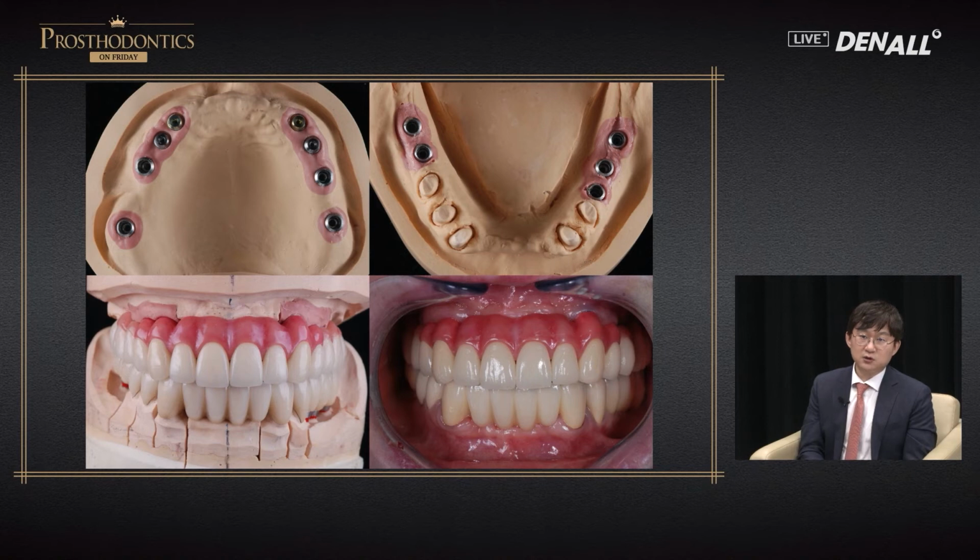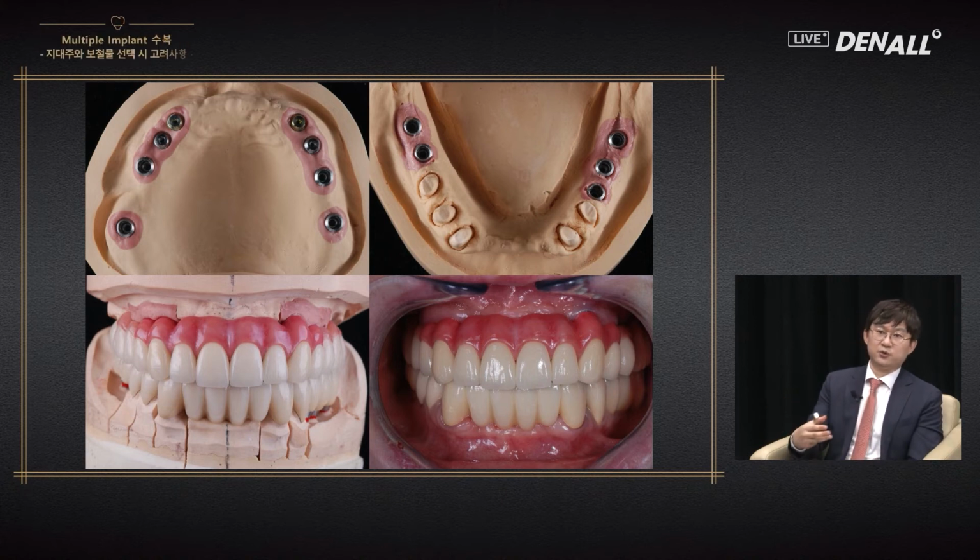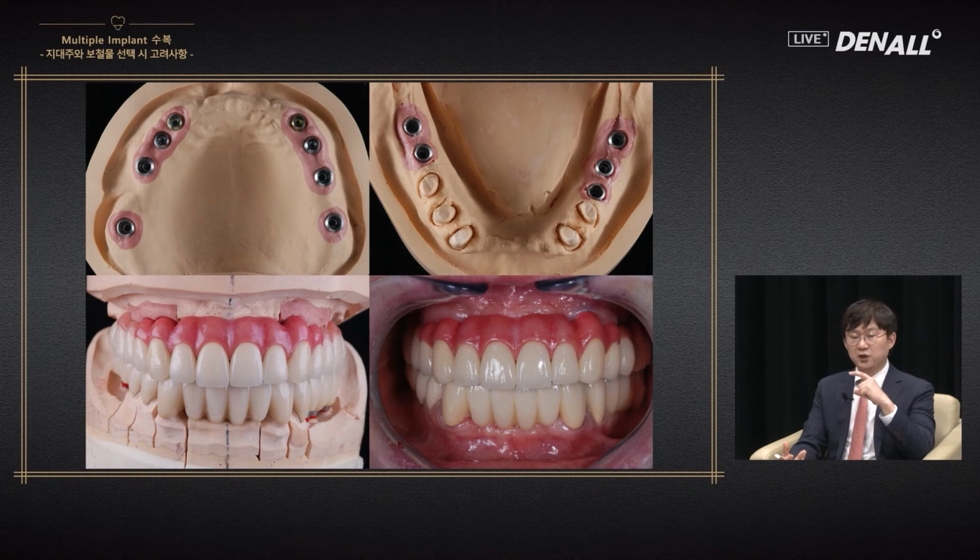This is a different implant case. The 3-4-3-4 implants are planned to be the screw type, and multi-unit abutments are connected. In the posterior region, tissue-level implants are placed. Cement type is used. For the anterior implants, the height is high. Four are splinted in combination, and if directions are different, it is difficult to remove them. So multi-unit abutments are used in this case.